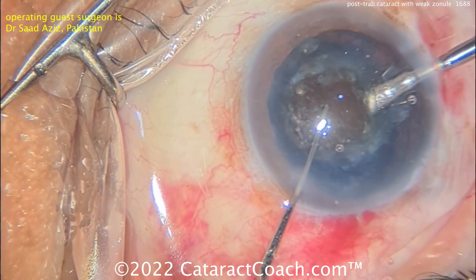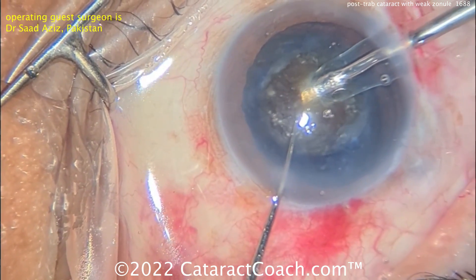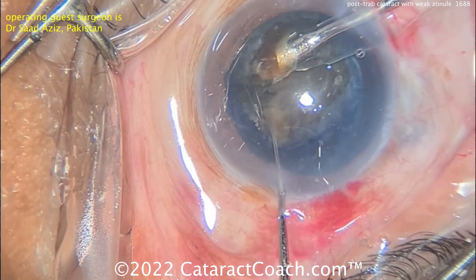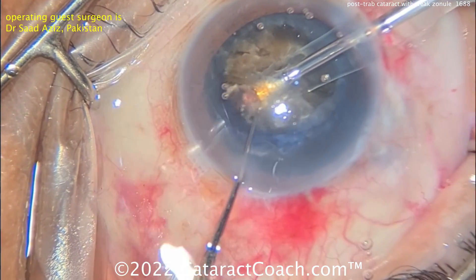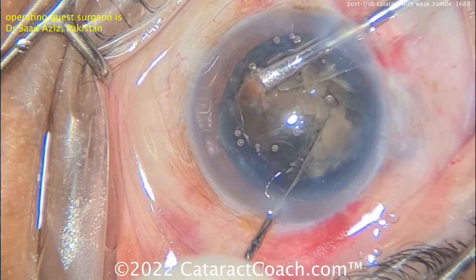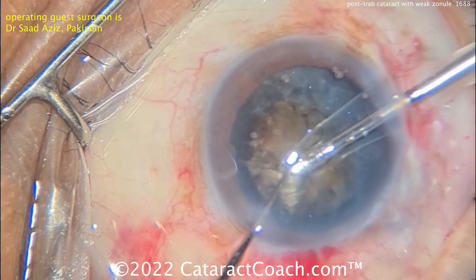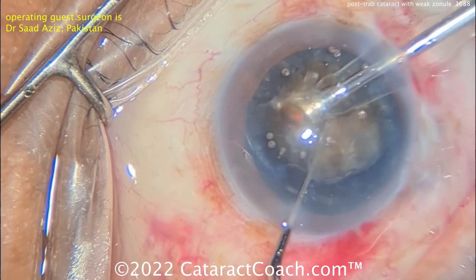Now let's see the nucleus removal. I'll also tell you to be extra cautious in eyes with a prior history of angle closure — they can actually have very weak zonular support. Buzzing over the phaco probe and getting that chopper nice and deep. Let's see if you can propagate that chop — it's a pretty dense cataract. That's a nice-looking chop. Get that split all the way through; if it doesn't go all the way through, no big deal, just buzz in again and try more. Sometimes these dense cataracts are petaloid — like petals of a flower — and the posterior lens plate is fibrous and sticky, preventing pieces from fully separating. The solution there is just chop, chop, and more chop. Multiple chops over and over — really good job here.